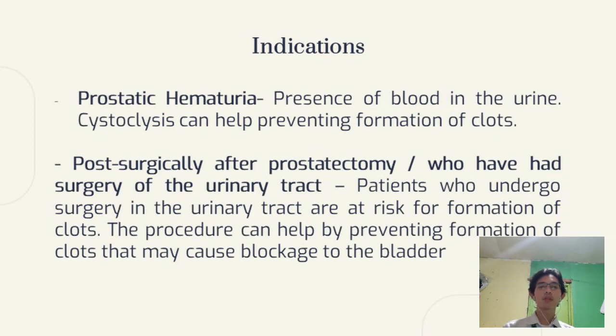Next is post-surgically after prostatectomy, for patients who have had surgery of the urinary tract. Patients who undergo surgery in the urinary tract are at risk for formation of clots. The procedure can help by preventing formation of clots that may cause blockage to the bladder.